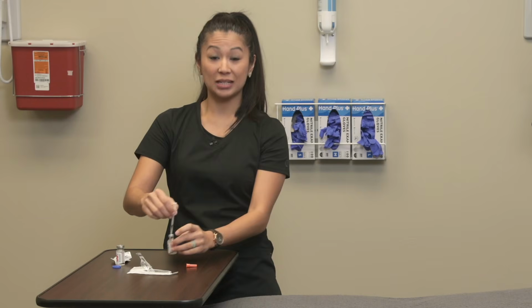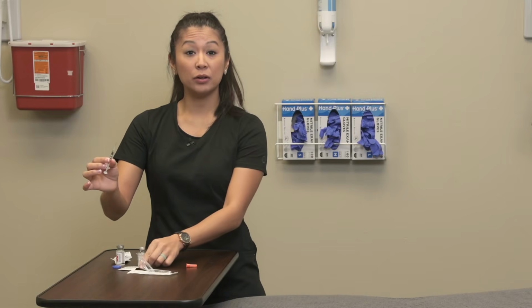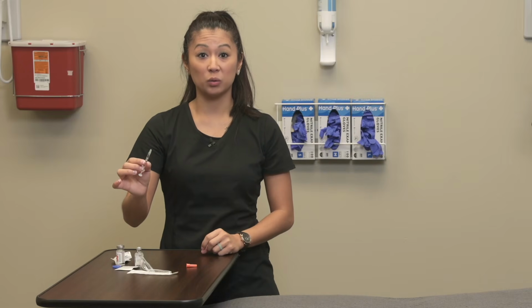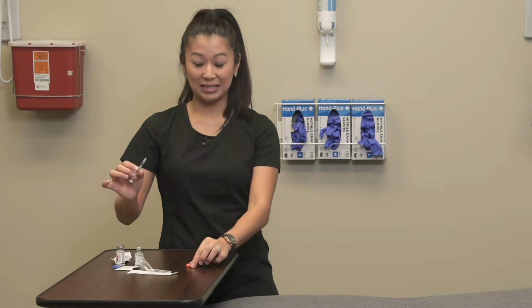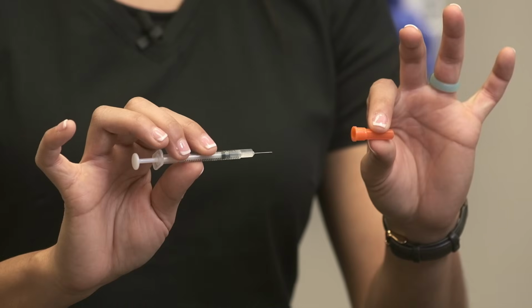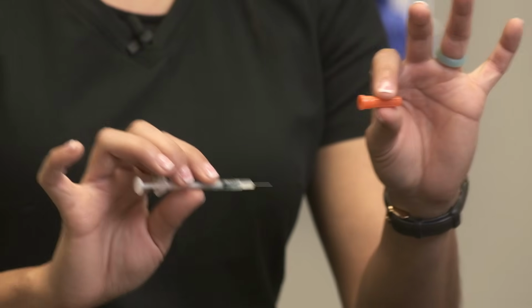So I'm going to push this back down. I've got my needle. Now you notice my needle is exposed. Here's what we do not want you to do: take this cap and recap in the air. As you can imagine, I could stick myself, I could miss.